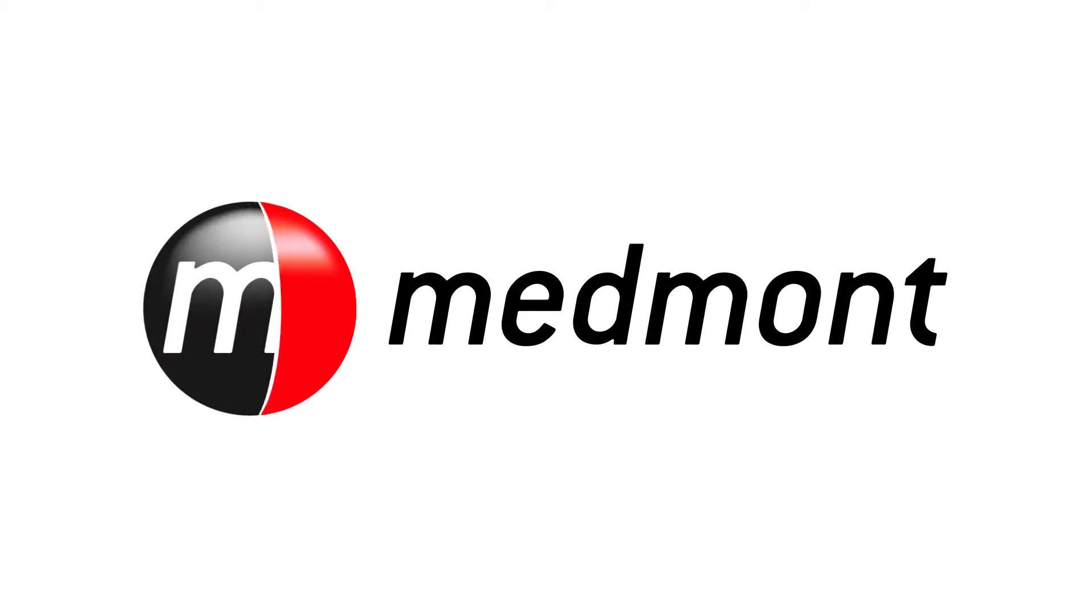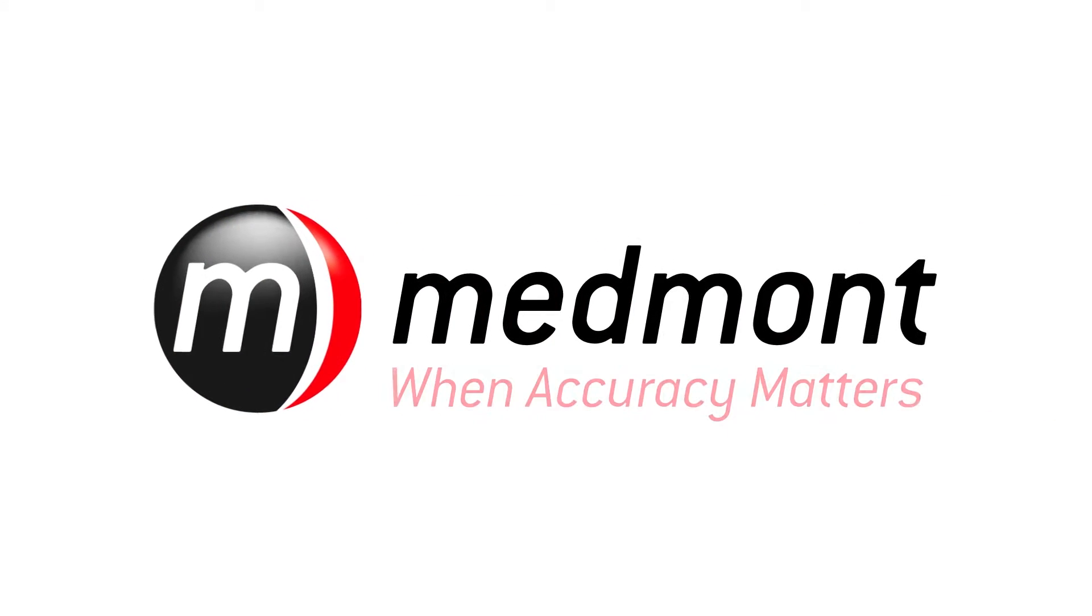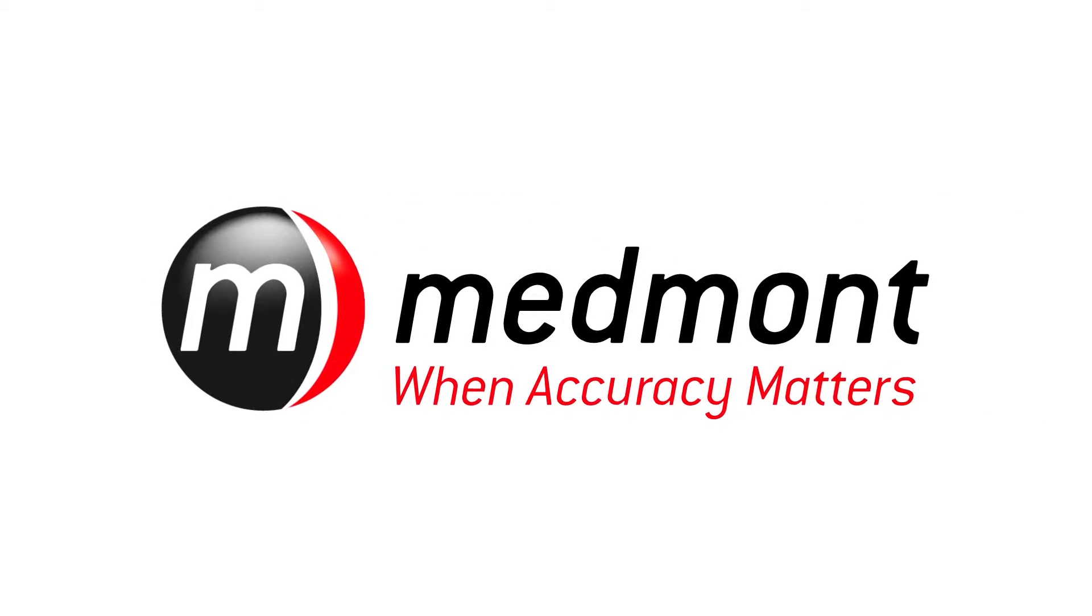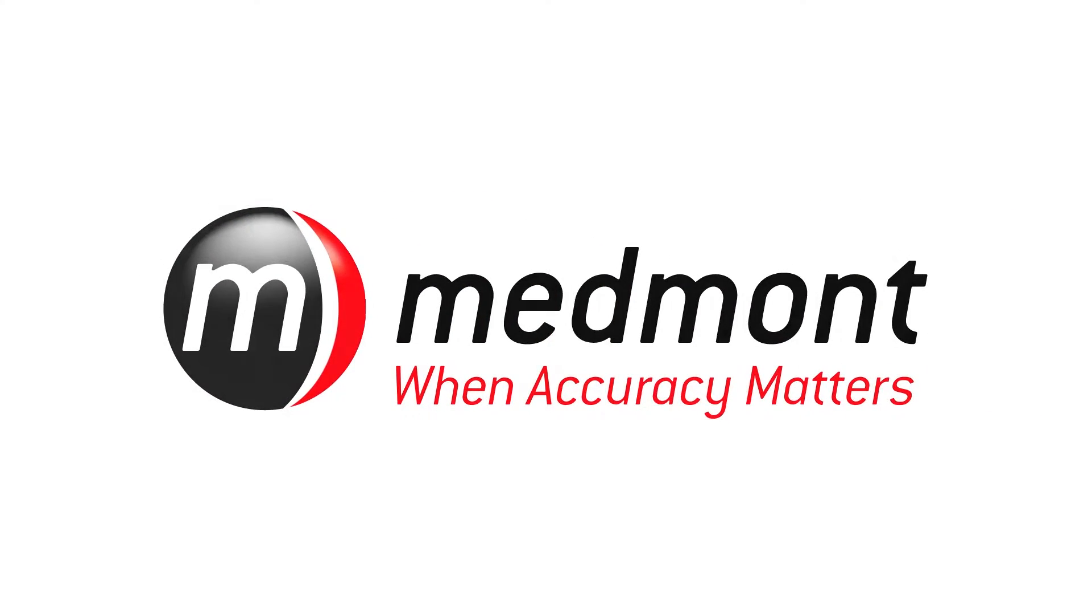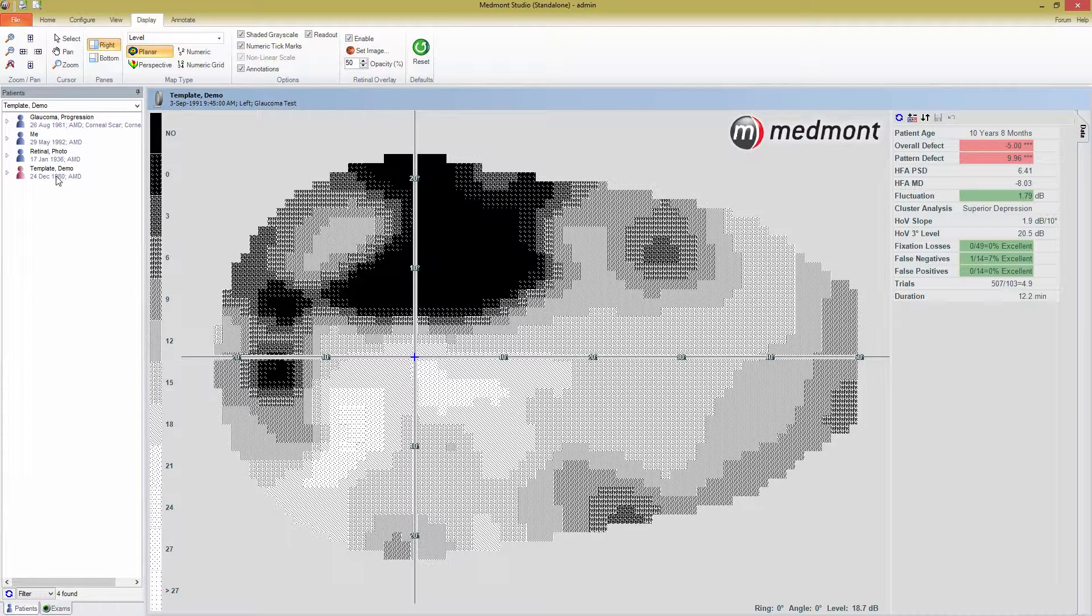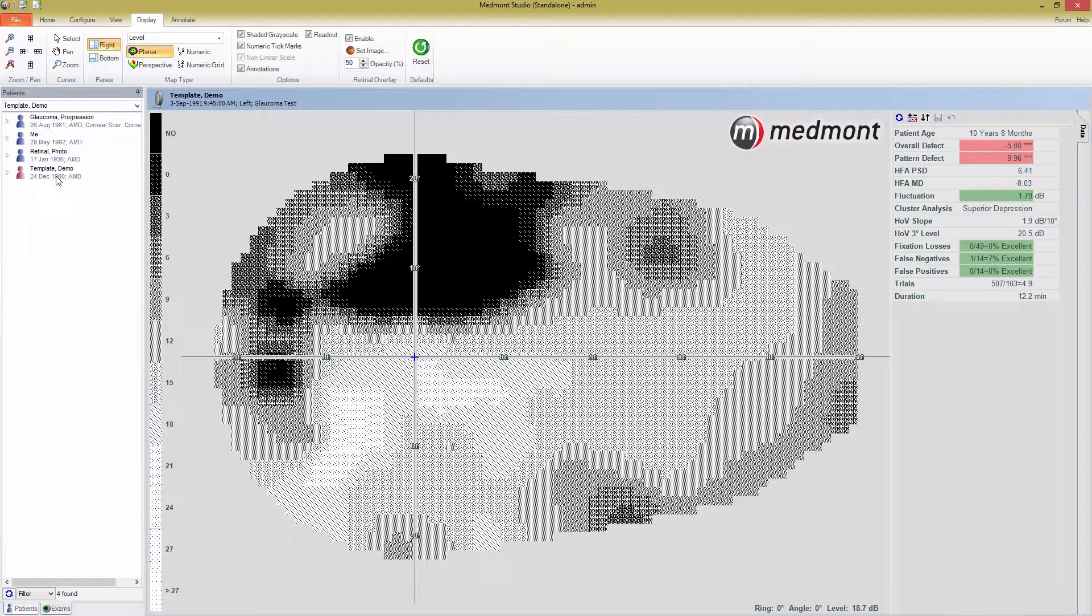Hello, and welcome back to Medmont's M700 tutorial videos. Now that you've watched the first videos in this series, you're an expert at visual field testing. But what about analyzing the results? In this tutorial, I'll discuss the view and display tabs, various outputs for displaying data, and how to best visualize your perimetry results.